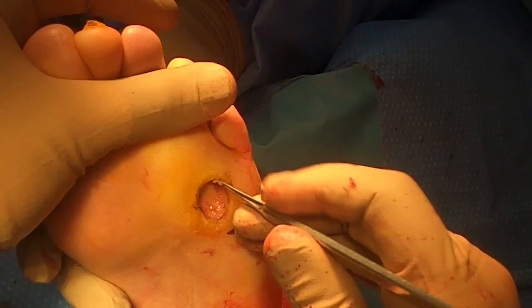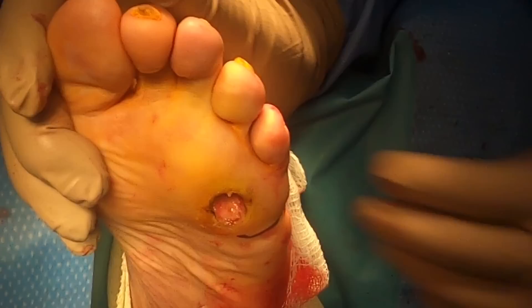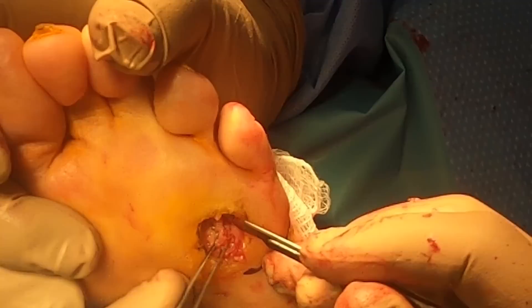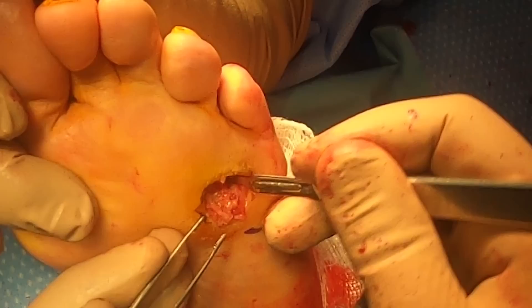A transfer lesion is when the wound develops at the next level of pressure point of the metatarsal. This patient is very prone to wounds, so we're trying to salvage his foot and do a procedure where we can avoid having to amputate part of his foot. You can see here my blade is right on the bone — it's already a little soft — and there's a high suspicion of bone infection. This is definitely needing to come out.